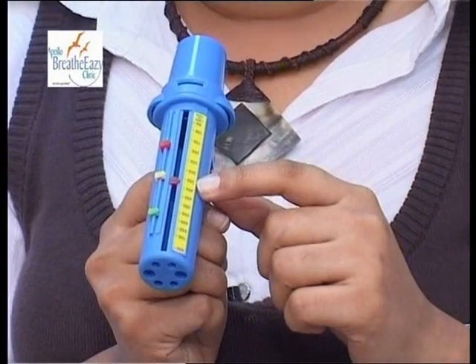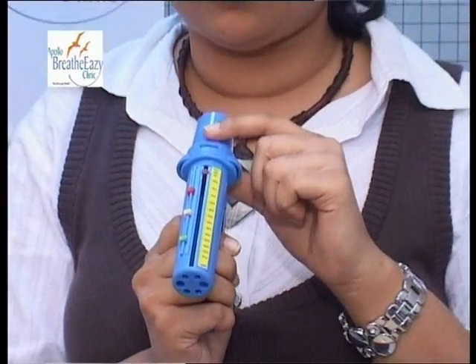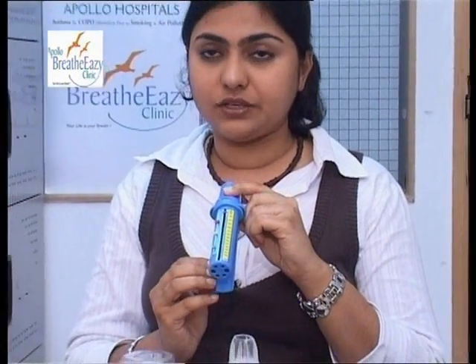Inhale and exhale forcefully into the meter and record the marking. This is done three times. The best of the three readings is taken as your reading. For example, if your best has been 350, then your reading is 350.